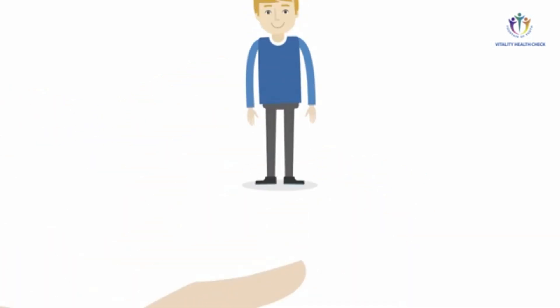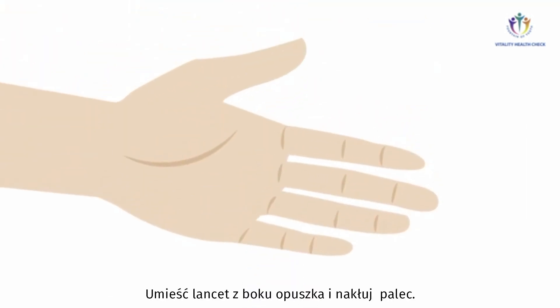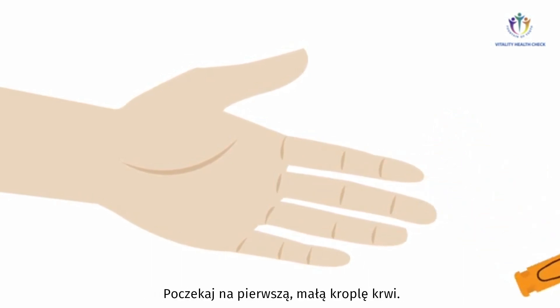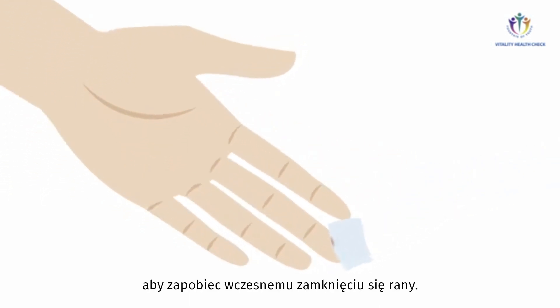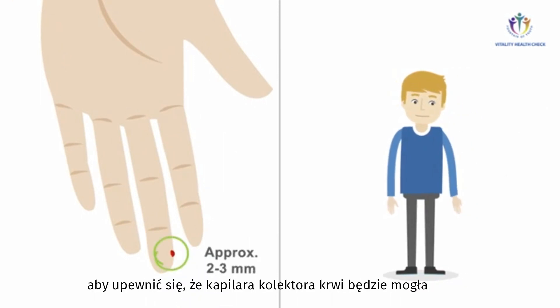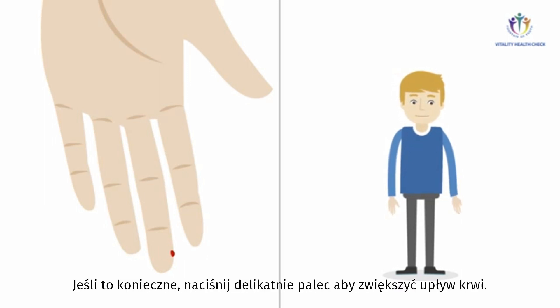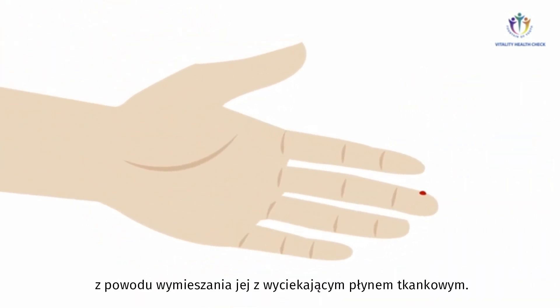Clean the previously warmed finger of the test person with a disinfectant and note the recommended action time. For optimal blood flow, your subject should stand up with their hand hanging down. Place a safety lancet at the side of the fingertip and perform the finger prick. Wait for a first small blood drop to form, then remove it using a swab to prevent early wound closure. Make sure not to squeeze or milk the finger, as this might cause dilution of vitamin D in the sample by leaking tissue fluid.